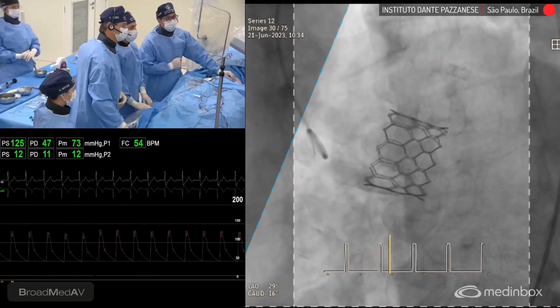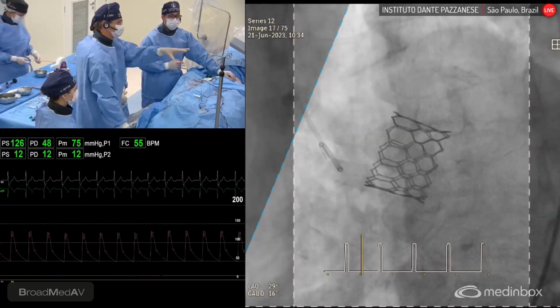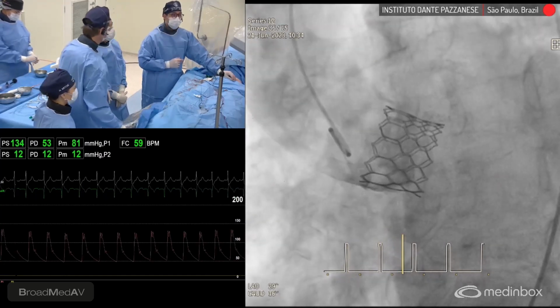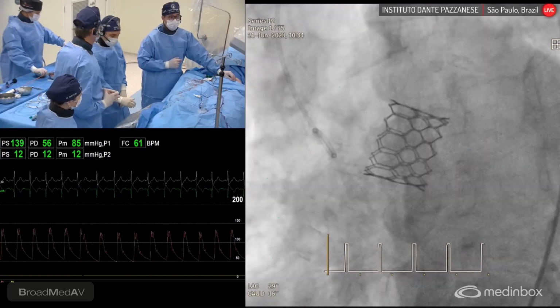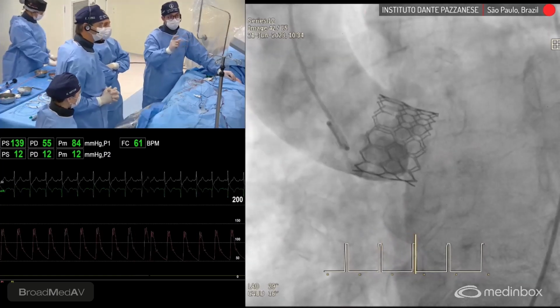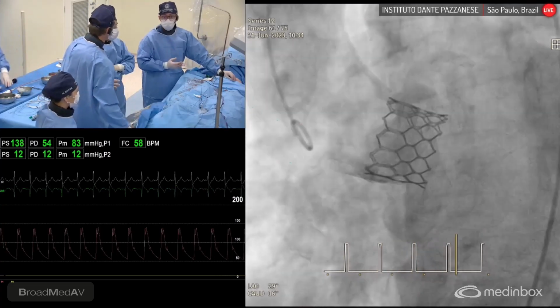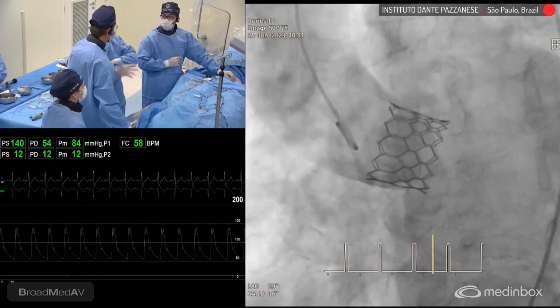So how can you access the left coronary artery in this? Have you done some cases? I can see some calcified arteries up there in the left anterior descending. So if you need some procedure in the coronary, it's going to be easy. You can see that the valve has a bigger diamond. So usually we use this place. Have you done that? Yes, we have done it. These are open cells. Yes, I could see the open cells.